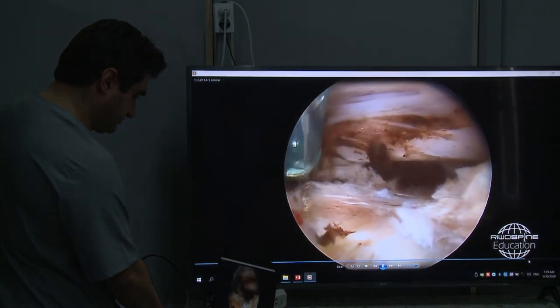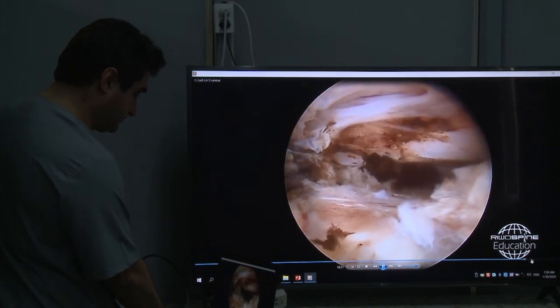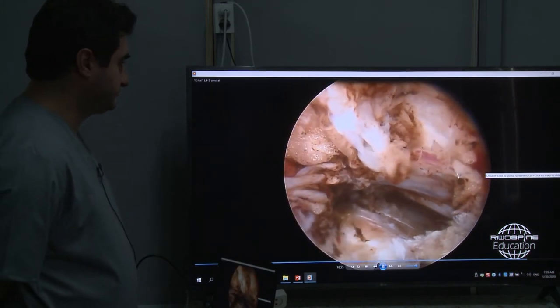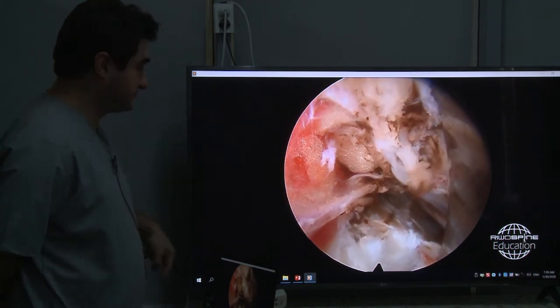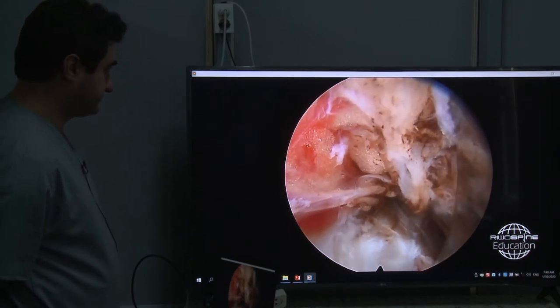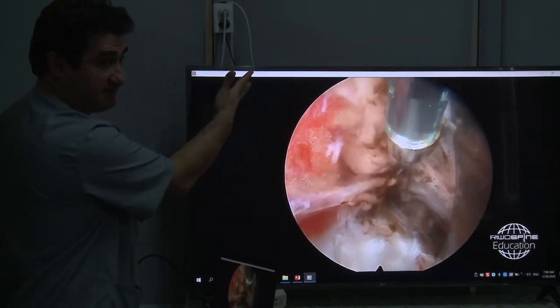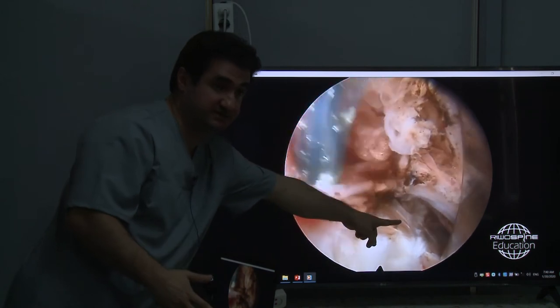Problems that you may have, adhesions. What I can show you is the situation I described when we are searching for the exiting nerve root. Now you cannulate, rotate the endoscope to the cranial aspect. Now he is looking to the cranial aspect. This is the cranial side of the foramen. This is the caudal side.